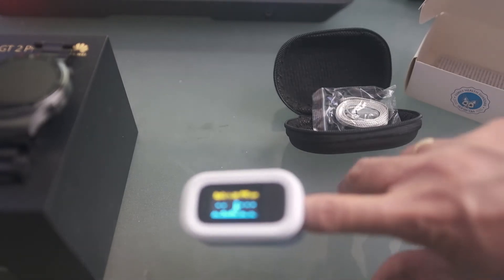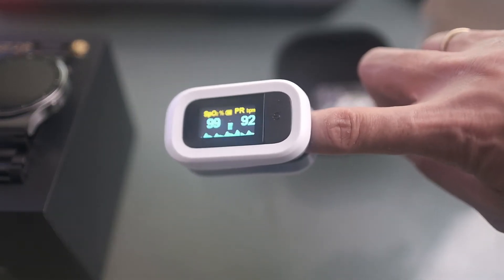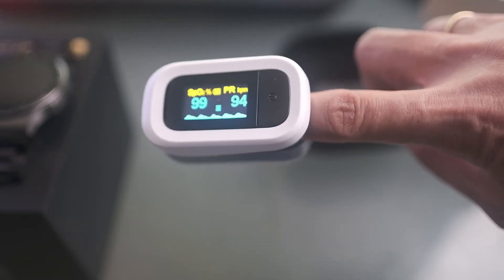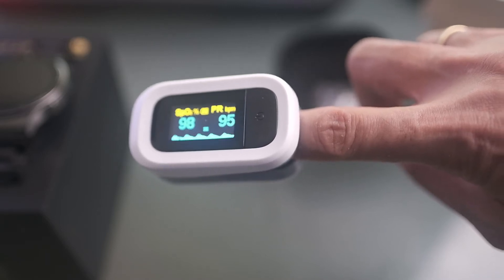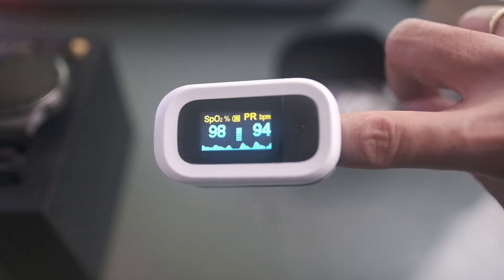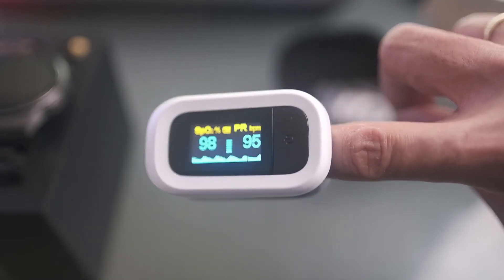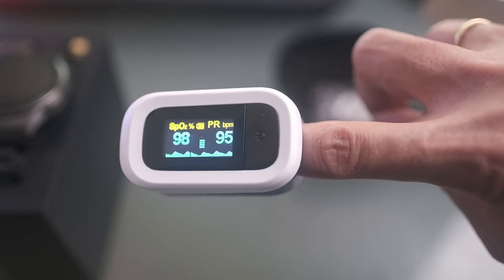Okay, I'm measuring now. The SpO2 says 99% and 94 beats per minute — that's the heart rate. Now it's reading 98% on the medical-grade pulse oximeter, with 95 beats per minute.